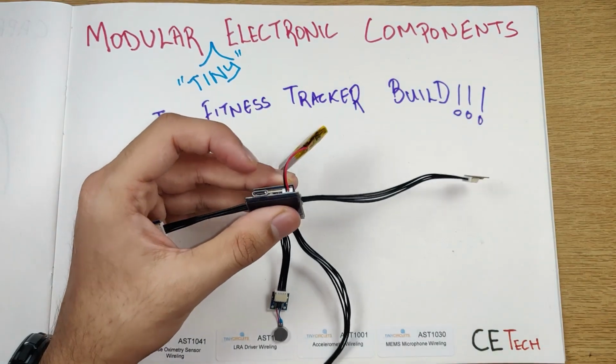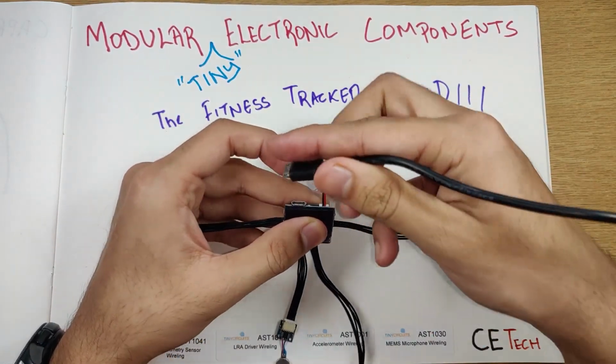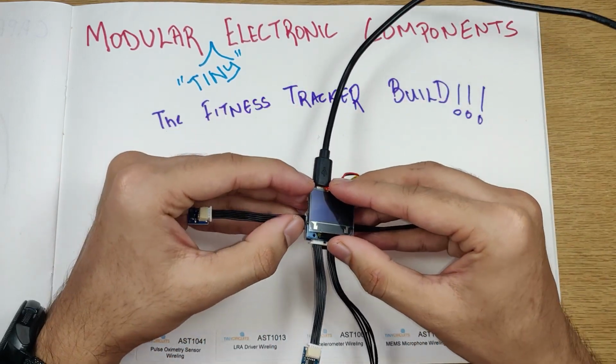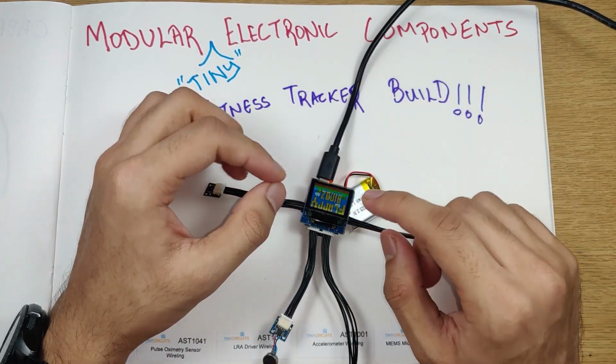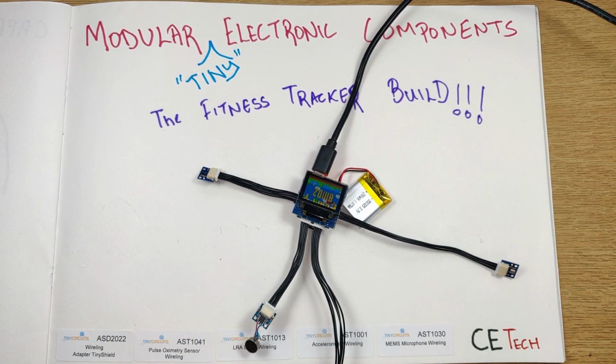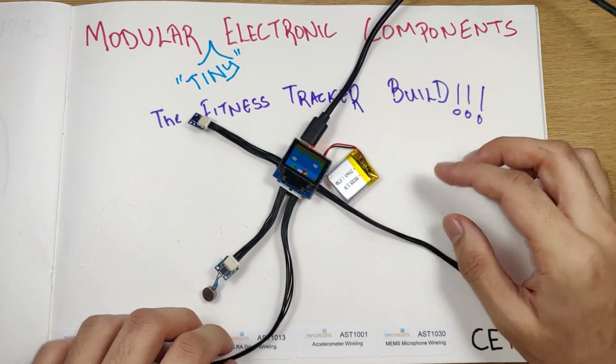Now what we just need to do is connect this to our computer using the micro USB cable. We need to switch it on so that we can program it as well. Right now it's on Flappy Bird mode, but once we program it, it'll be on another mode. Now let's head back to our computer.